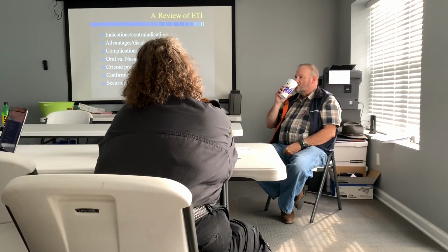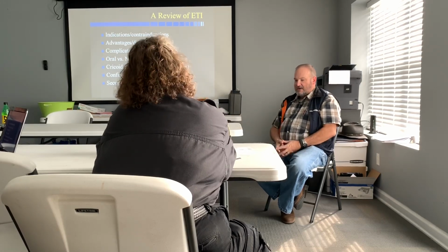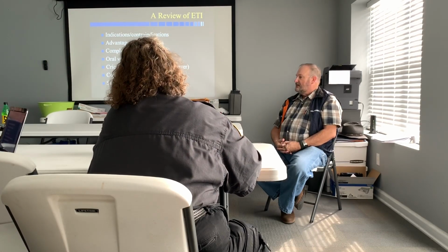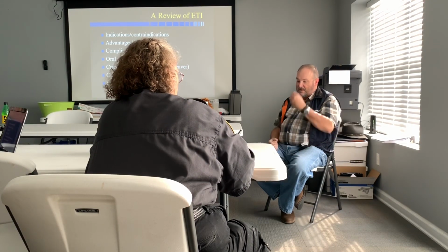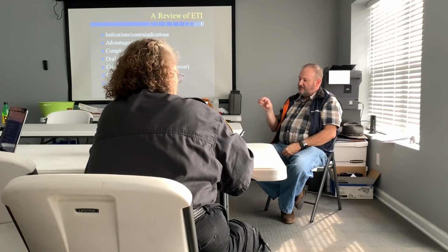What is Sellick's maneuver? Manipulate the trachea for visualization. Right. What's our mnemonic for Sellick's maneuver? BURP. Backward, upward, rightward pressure, right? Taking the trachea and displacing it maybe an inch to half an inch back and towards the right ear, just to facilitate pushing that semi-rigid trachea against the flaccid esophagus.